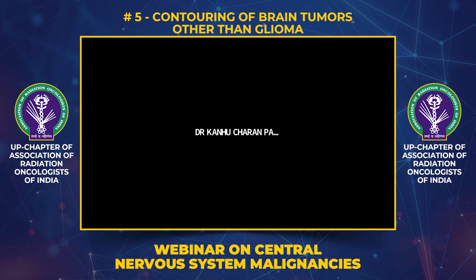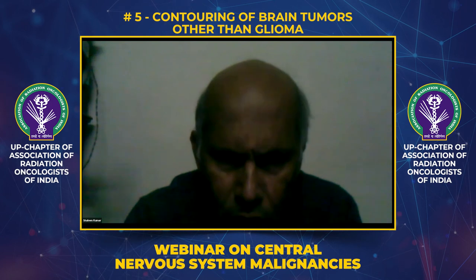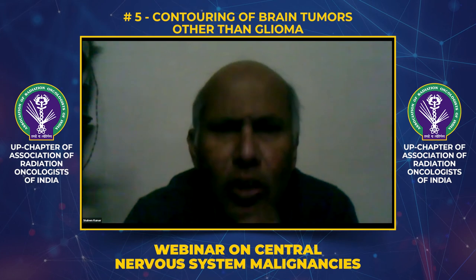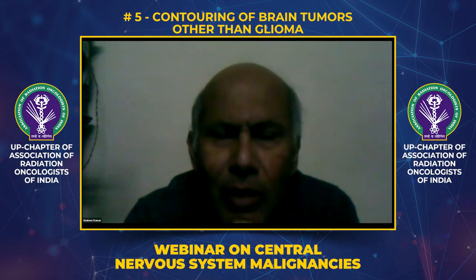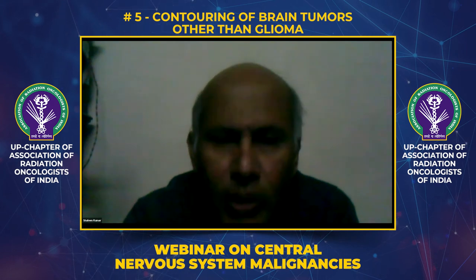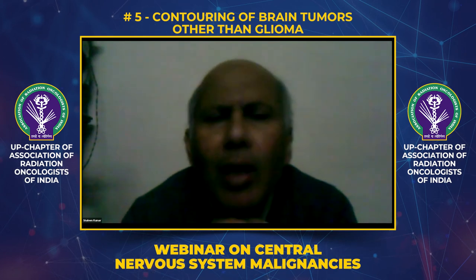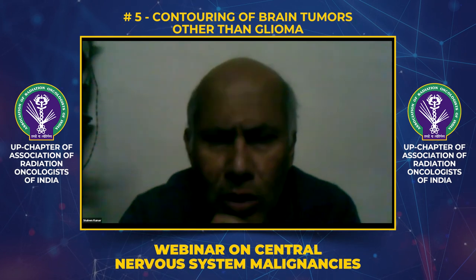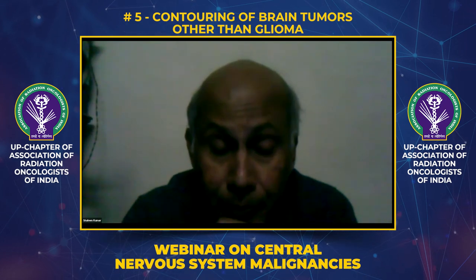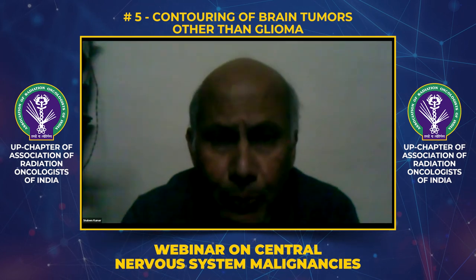Yes. So we would prefer the SAD technique, because then if you give a 90 degree couch rotation and take the gantry to 45, you can get isocentric. And so three field would be possible. I can't remember having done it, but in theory, I cannot see why we can't do it, just making sure there's no collision, and I don't anticipate there would be one. But otherwise, I liked your class solutions and simple approach. It's important to bring this up because many centers still have cobalt units, and nobody should feel left out. Yes, sir.